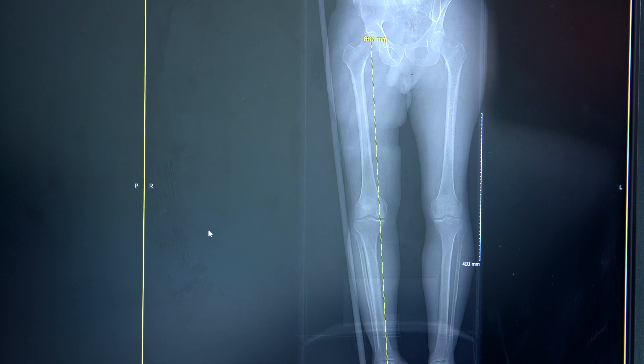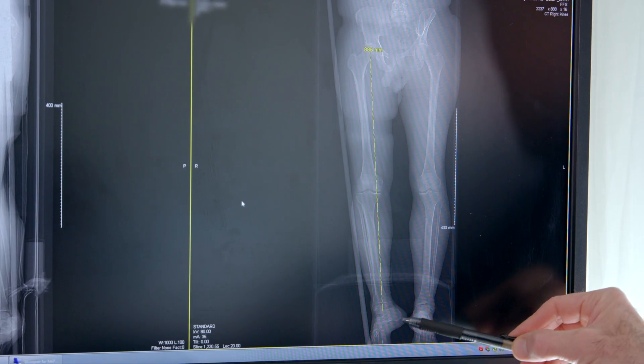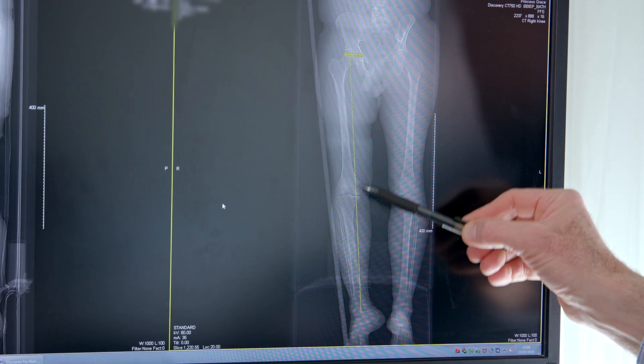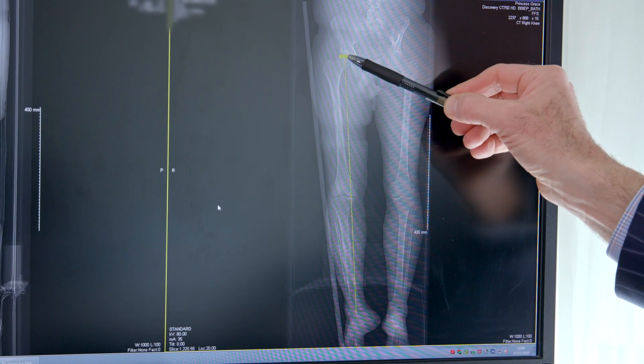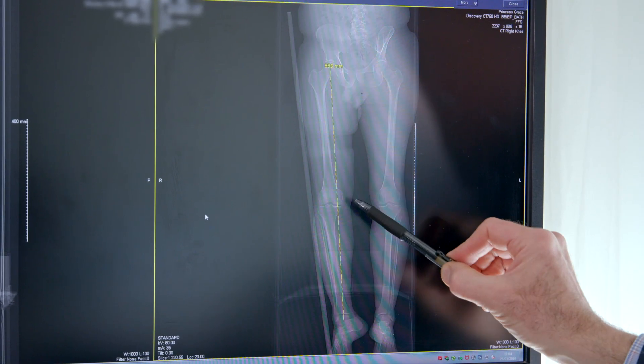These images on the screen are the first part of the CT scan, which provides us with the overall alignment of the patient. We have the pelvis up here and the foot and ankle down here. This is the knee, and the weight-bearing axis should run through the centre of the knee, but in fact from the hip to the ankle it's actually shifted across towards the damaged side. Once we've acquired the CT scan, we import it into the robot, which can then use the scan to plan the knee replacement, with extra information that I give it at the time of theatre.